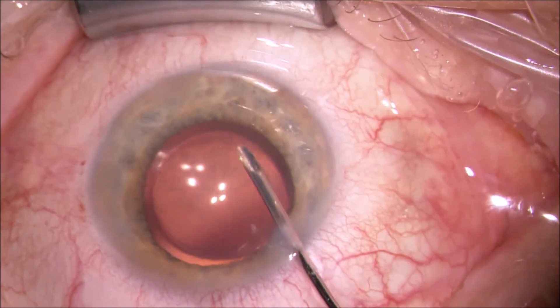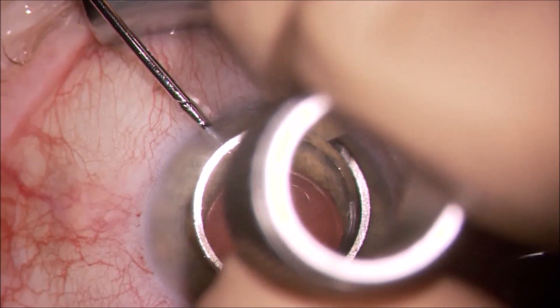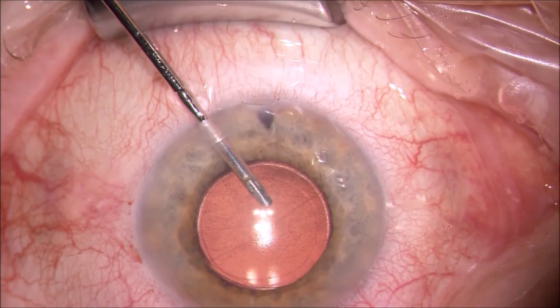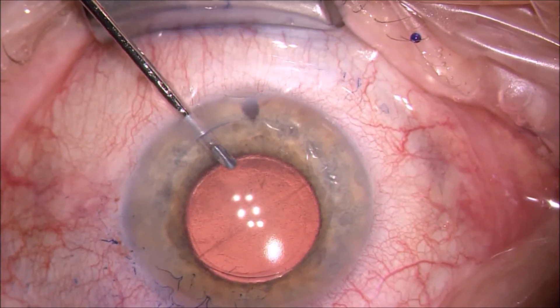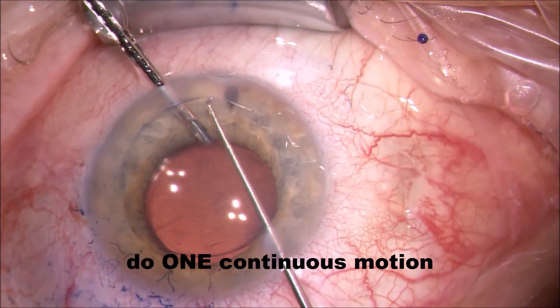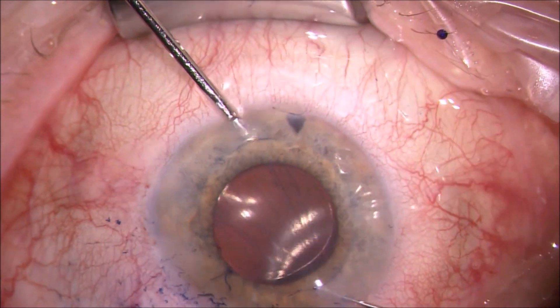The intraocular pressure of my infusion line is set to about 50 here — regular settings. As you see me here, I'm using my 7mm trephine with just a quarter twist in order to mark my rexis, and then staining it with trypan blue. A nice trick is to put trypan blue inside and then place the trephine over it — this way you won't have to restain the corneal surface, which makes it a bit more elegant. I'm pretty much inside the 7mm mark on the corneal surface.